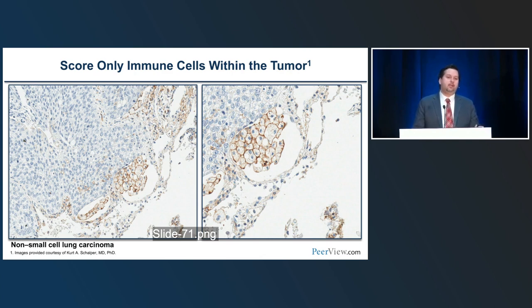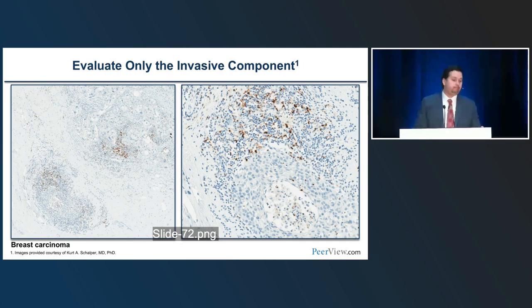So this is clinical judgment, and essentially we have to be aware that at the interface between tumor and non-tumor regions, there may be non-tumor areas that have PD-L1 expression, and they should not be included in the scoring. So again, this is a potentially problematic case.